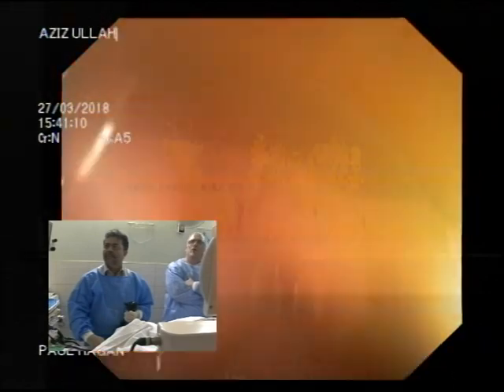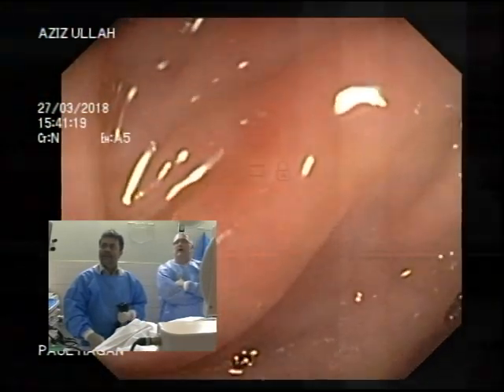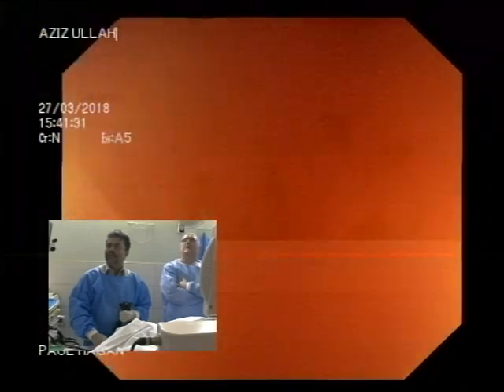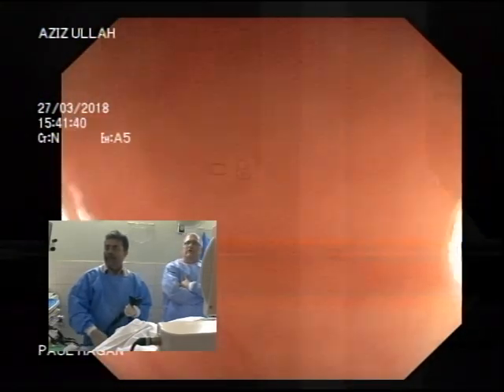Follow the folds and up you go. Follow the folds and up you go. Up. That's off to the side. Up. Good. Go on, commit. Good man. Clockwise torque. Stop, too much, anti-clockwise.